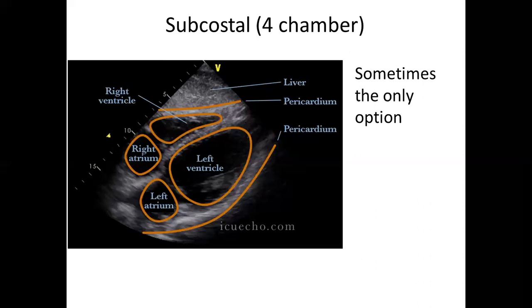Or another example, if your patient had massive trauma of the anterior thoracic wall and ribs, to be exact, we may have excessive bone callus, which may narrow and block intercostal spaces, and we are not able to evaluate the heart from this area.